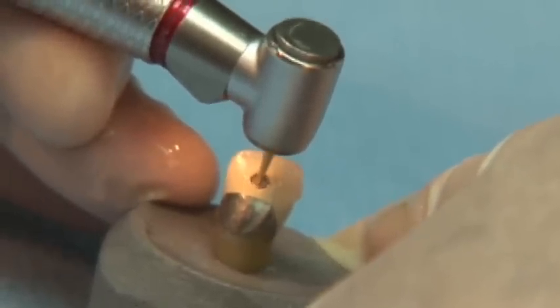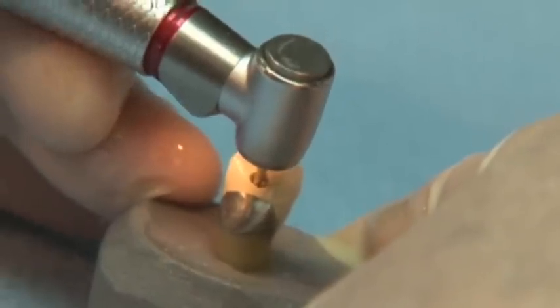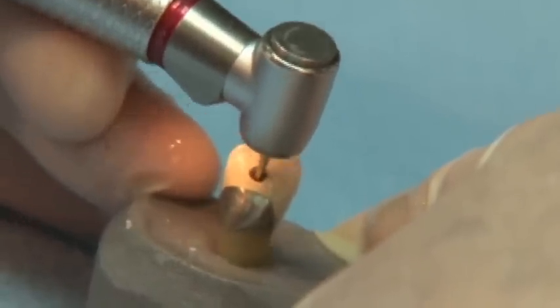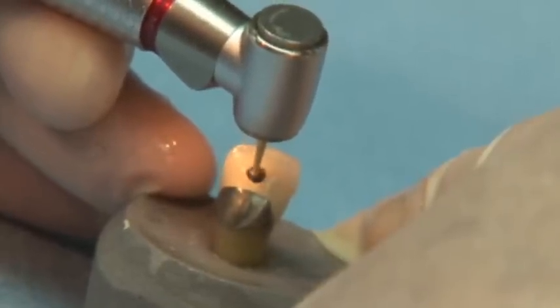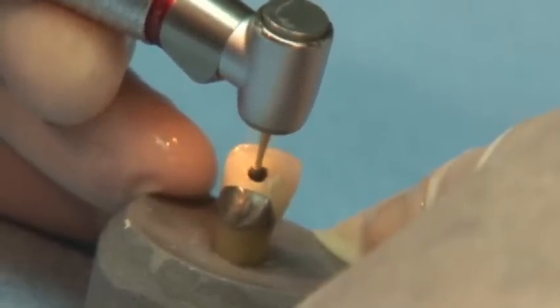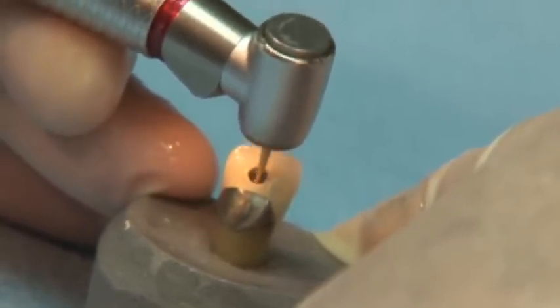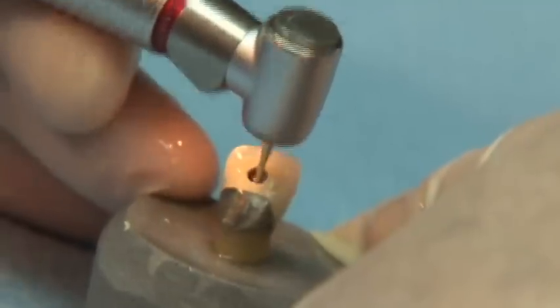S.S. White offers a selection of surgical length Great White Burrs. These burrs are available in round numbers 2, 4 and 6 as well as the ever popular number 557. The added length improves visibility and allows for deeper access.